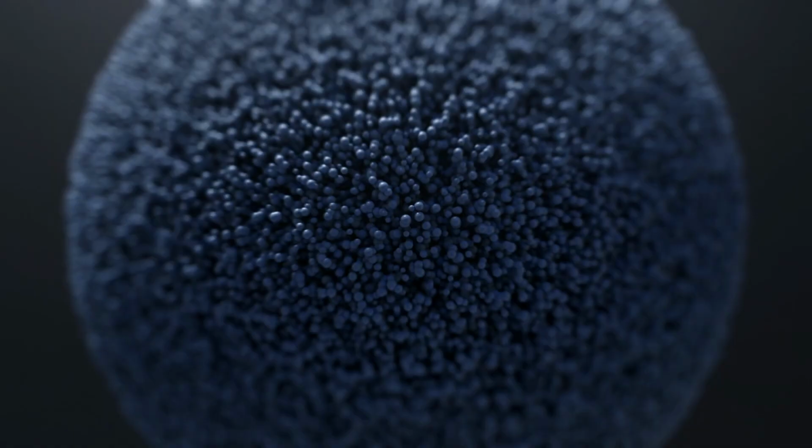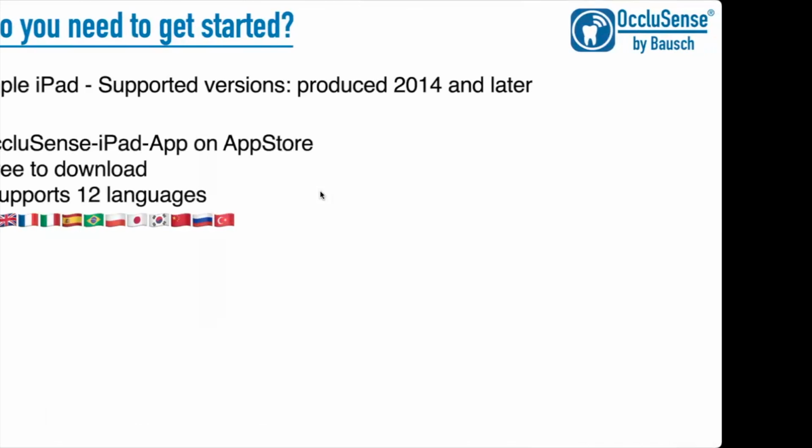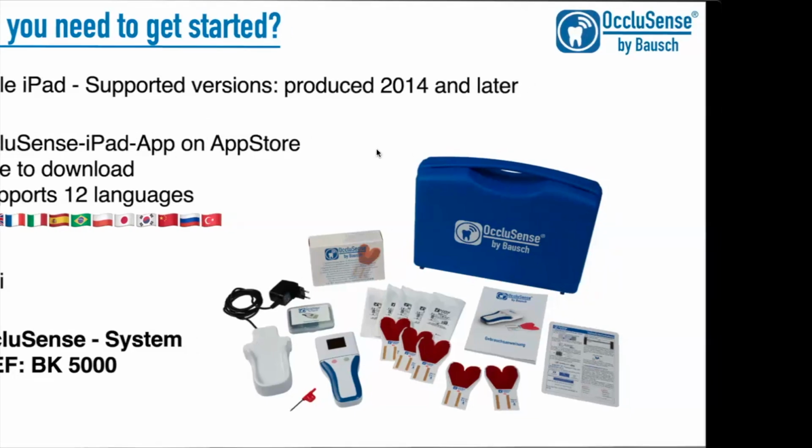And if you want to get started with OccluSense, what you need is an Apple iPad, produced 2014 or later. It's the iPad app, which can be downloaded for free from the Apple Store. You can select different languages. You need a Wi-Fi connection and the OccluSense system BK5000.